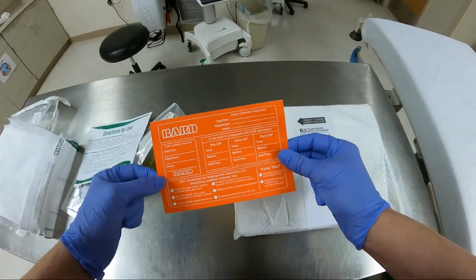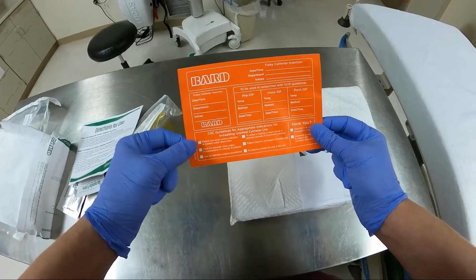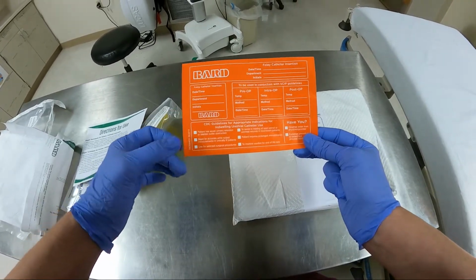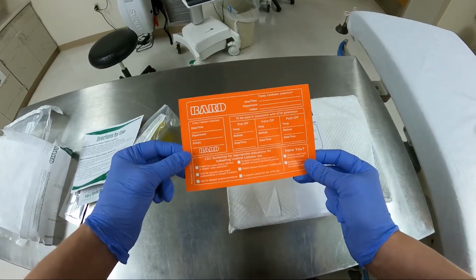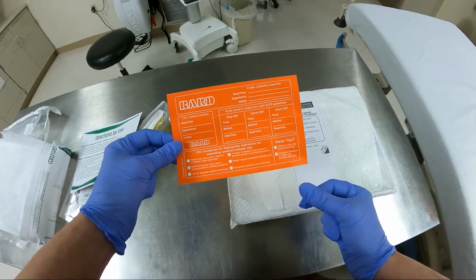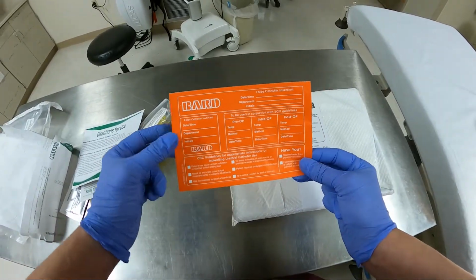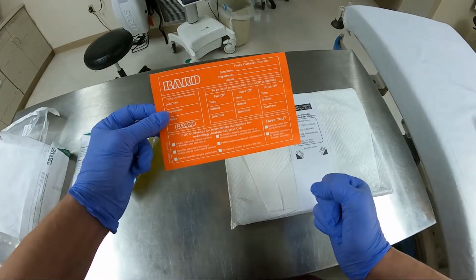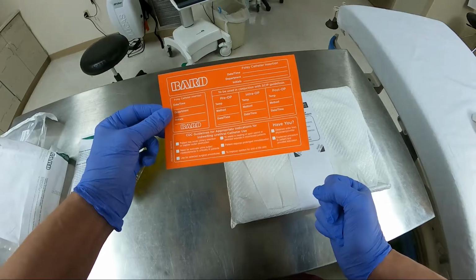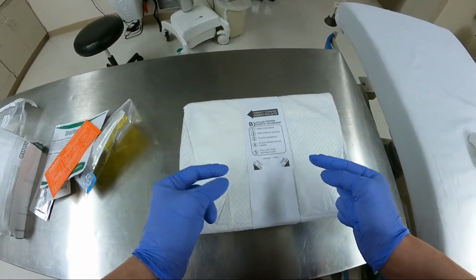We may end up starting to use these. This is an orange sticker that highlights the fact that we are putting in a catheter, when it was started, and all that stuff. Because we need to do surveillance of catheter insertions to be able to determine what our rates of infection are, these are going to end up, right now, on a card filled out and then put under Jen's door. Or you can give them to me.